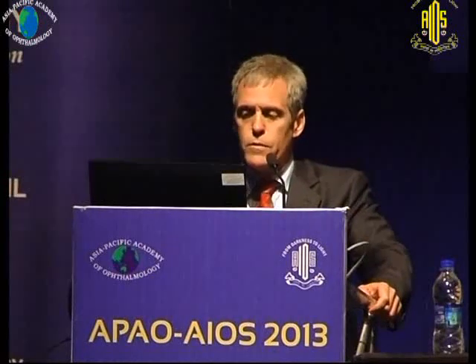For the anterior segment surgeon, it's worth recognising the anterior versus posterior dividing line. Once nuclear and cataract material is in the posterior segment, it requires a posterior approach, and you need to avoid the temptation to go fishing. That's actually in New Zealand. Phil, I'll put that in there for you.